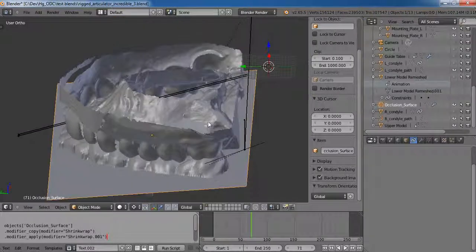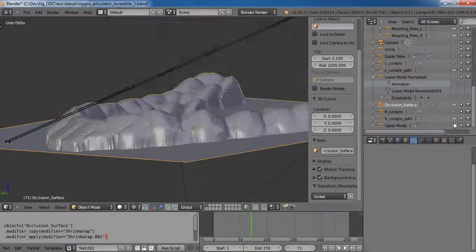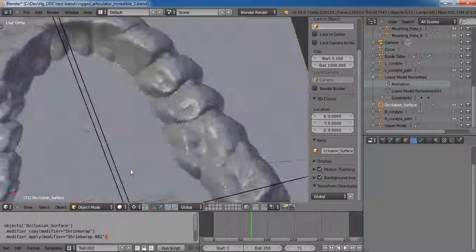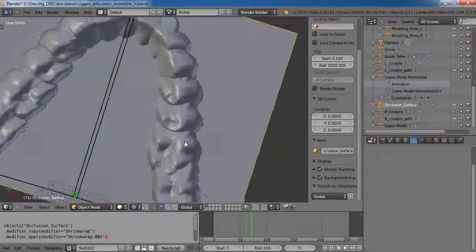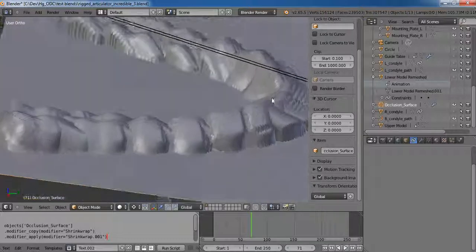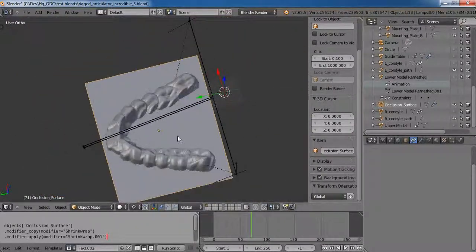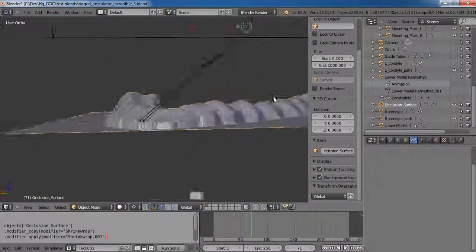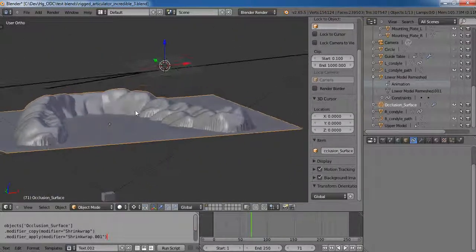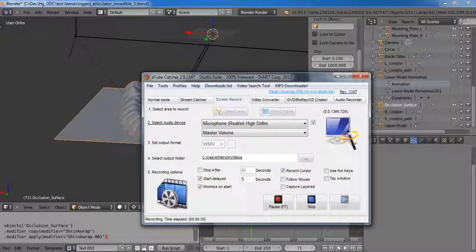Okay, so now if we were building a full set of teeth against this lower model, we would have this generated surface here which would show us the full range of motion, which would allow us to build whatever occlusion we wanted against these without interferences. So sorry for the slow manual demonstration there, but that is what that would allow us to do. So pretty neat. Hope that you liked it, and I will be updating soon.